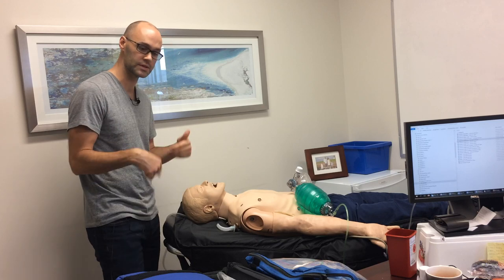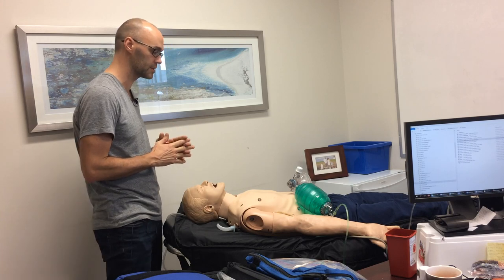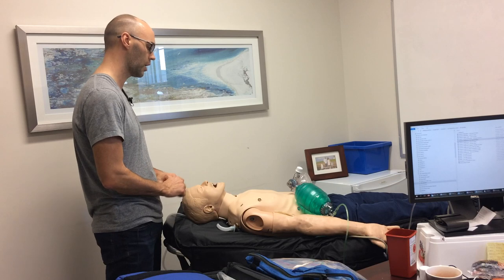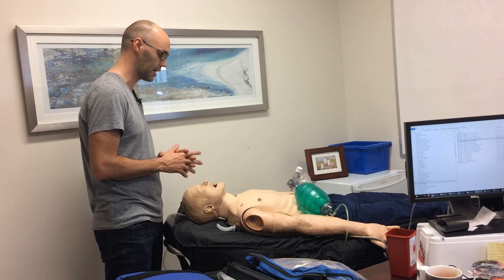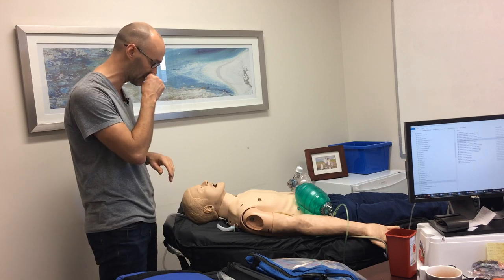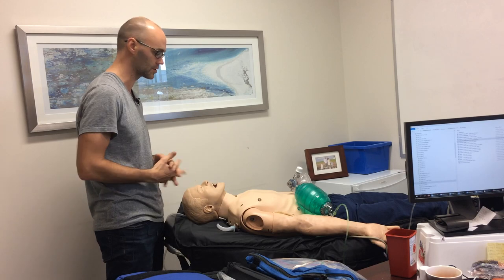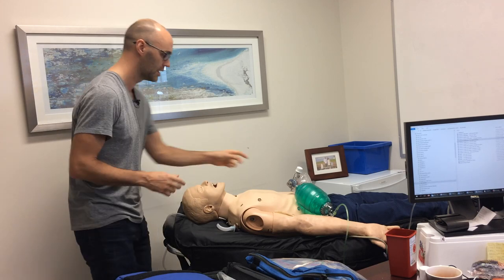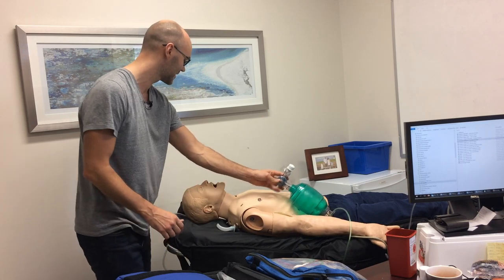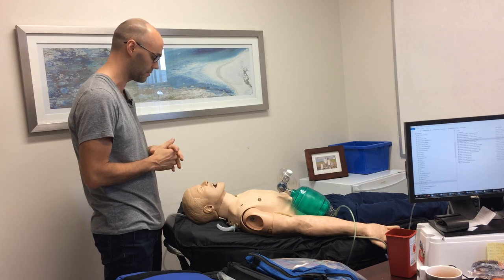Once we've gone through LEMON, we need to go through and see what our backup plans are going to look like. We're using BOOTS: whether or not we have a beard, if they're an older patient, have obesity, if they're toothless, or have any adventitious sounds — snoring, stridor, or anything like that. This patient has none of those, and we're pretending I have a partner here currently pre-oxygenating with the bag valve mask. I've got my PEEP valve on and my reservoir bag, so they're oxygenated appropriately. I feel like bag valve mask will continue.